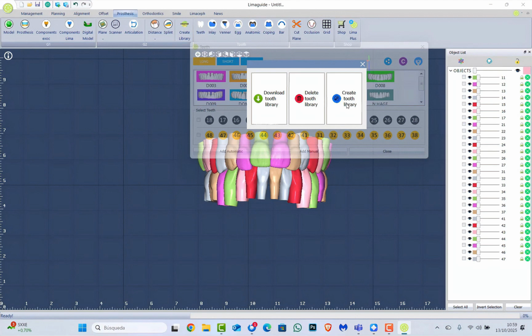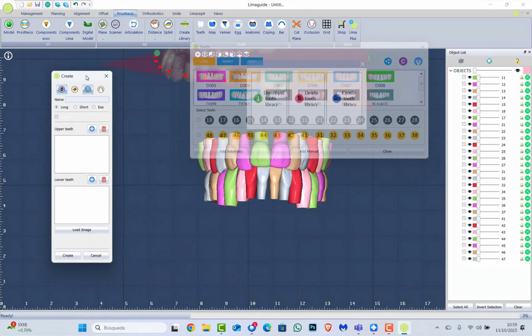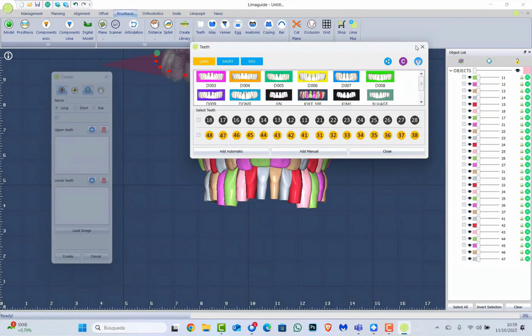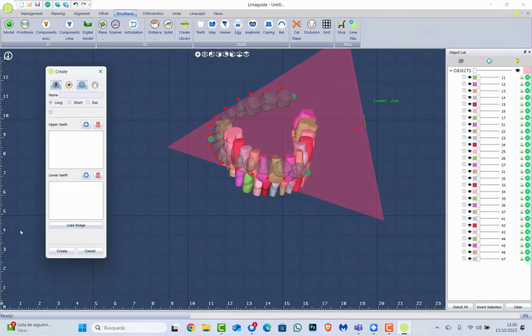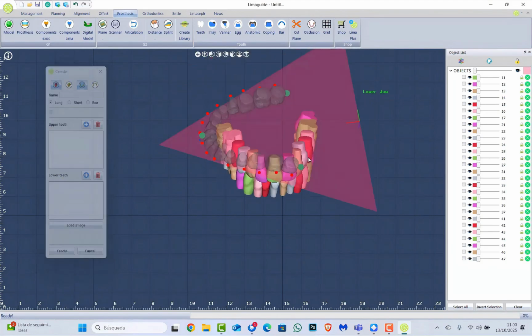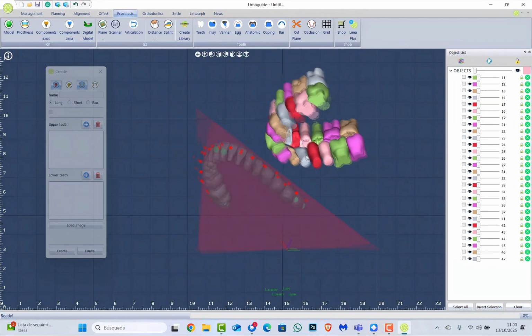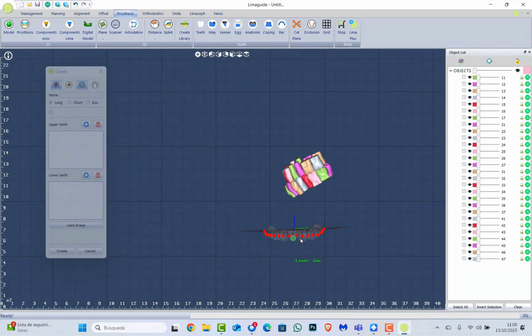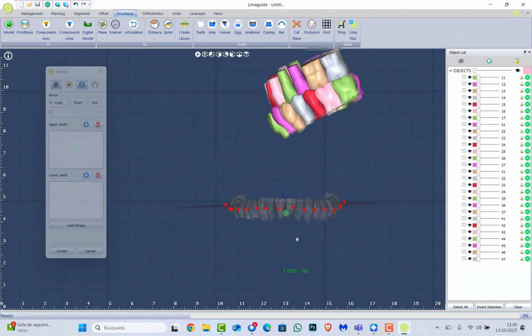So I'm going to choose to create a new teeth library. It's going to open this new window and I'm going to close the previous ones. This window will allow us to create our next library. As you can see, now I have to move all my teeth to this blueprint that has appeared under here. So now I'm going to move all my teeth.